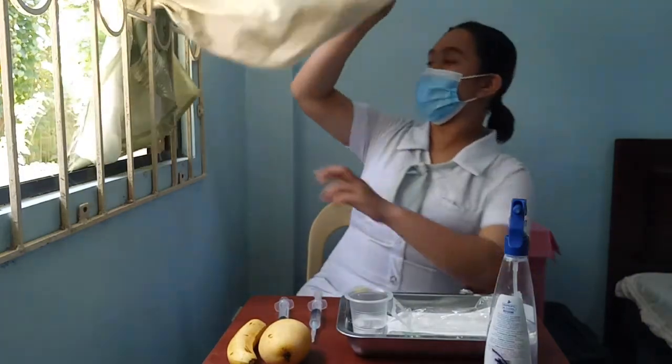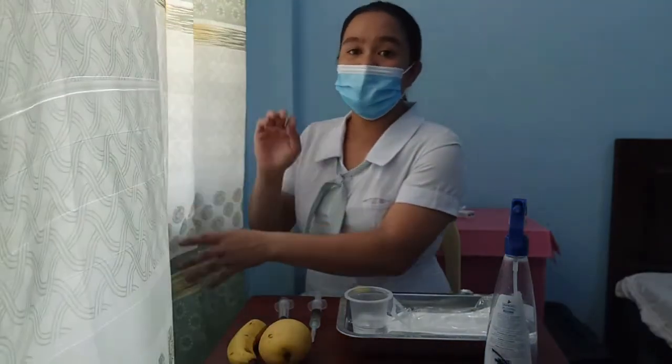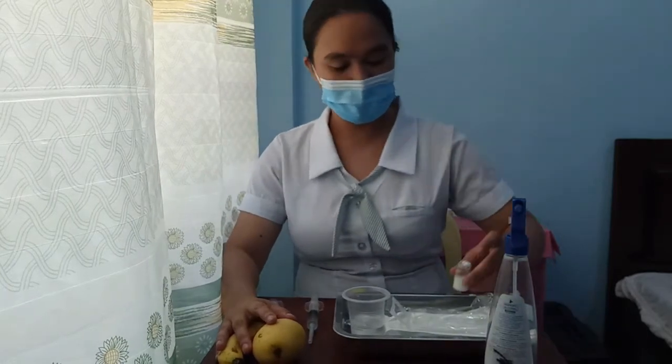Next is explain to the client that the medication will produce a small bleb or small circle. The rationale for this is that explaining it to the client will help them to understand the situation. Next is provide privacy. The rationale for this is to ensure the client's privacy and safety.